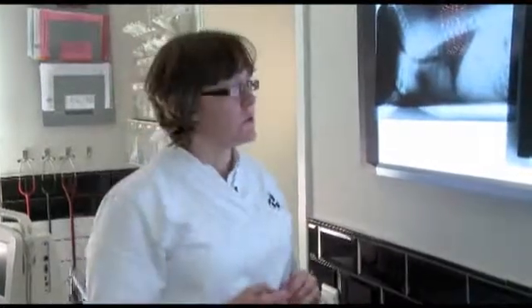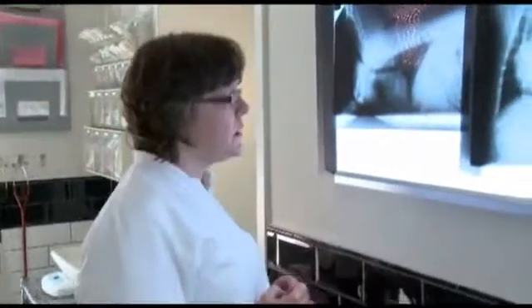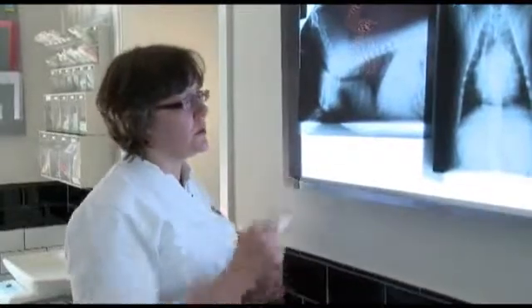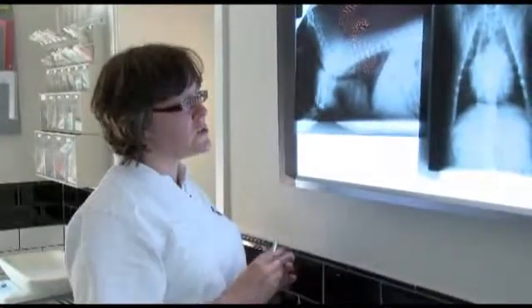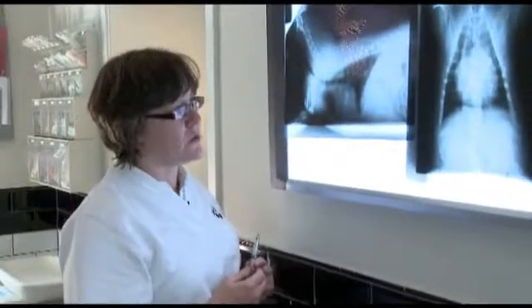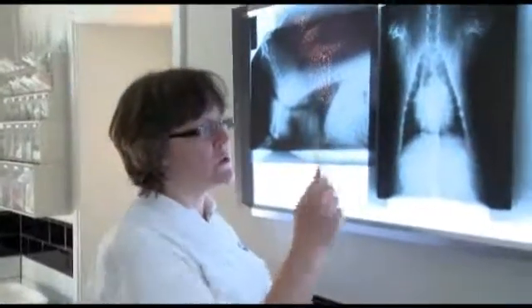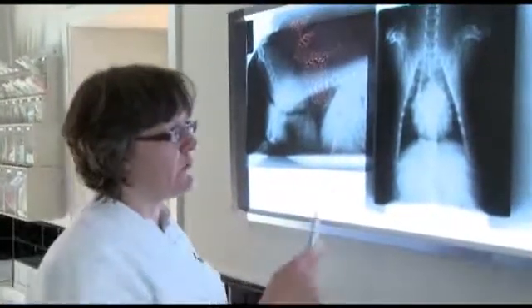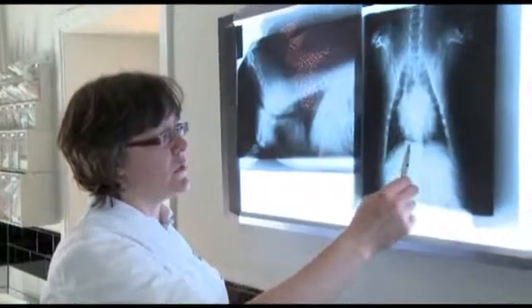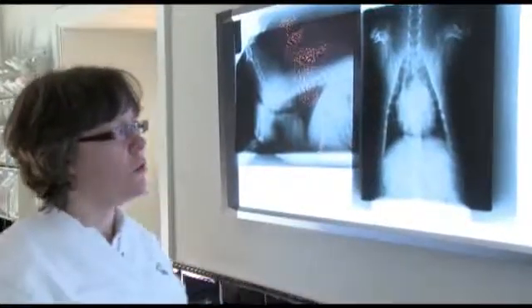Right ventricular enlargement can be secondary to eccentric hypertrophy or concentric hypertrophy. The right ventricle is visible on the lateral radiograph as the cranial heart shadow border, but be careful when there is left ventricular enlargement, the heart can be twisted around and we can get false right ventricular enlargement. Therefore it is always important to look as well at the dorsal ventral radiograph where we can see the enlargement of the right ventricle from the 6 to 11 o'clock position.